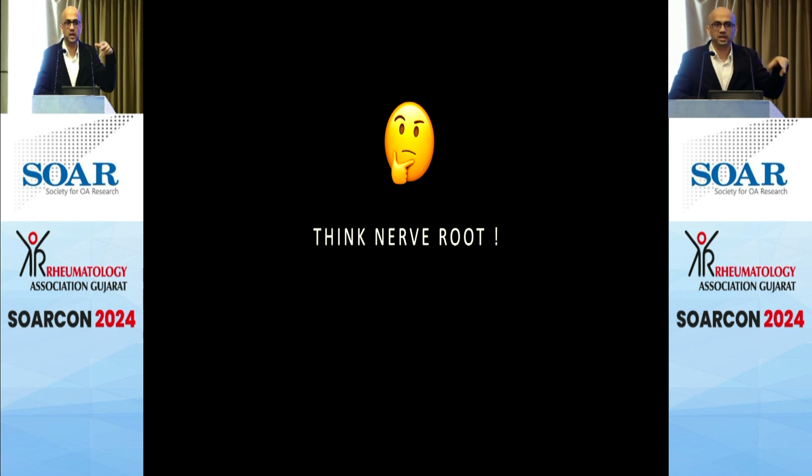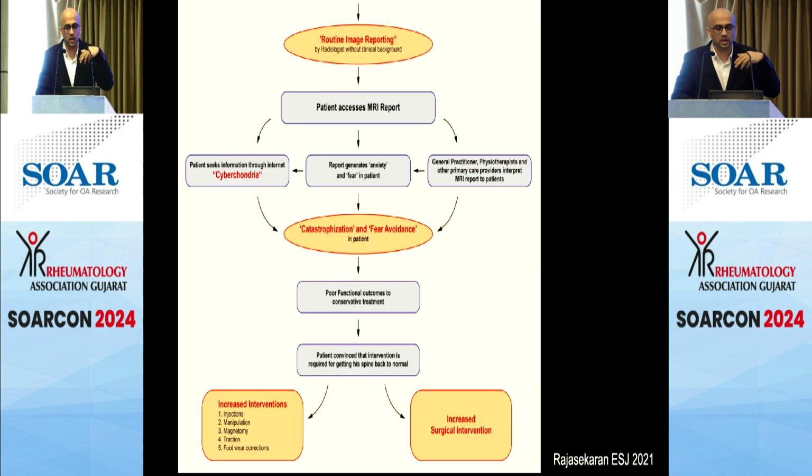The patient can have a sciatica syndrome and have an L1, L2 disc herniation, and then it doesn't match, because that person should have an anterior thigh pain. So that's the difference between seeing the description of an MRI and correlating it with your symptoms. So these are the last few slides.